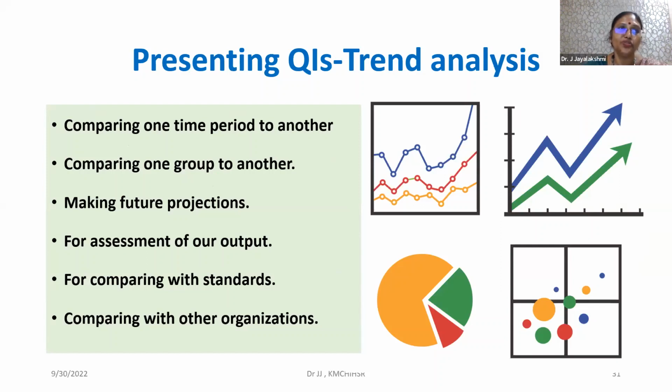For all metrics related to issues, you always want a downtrend. And all metrics related to compliance to good practices, you want to have an uptrend. So always look at where you are compared to where you want to be. Your benchmark is where you want to be, and where you are is where you are already. And you should look month to month to see whether you are improving.